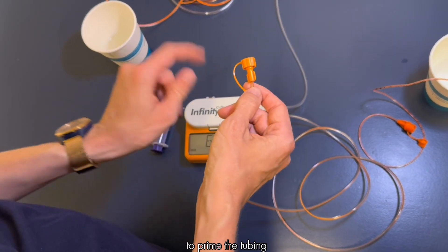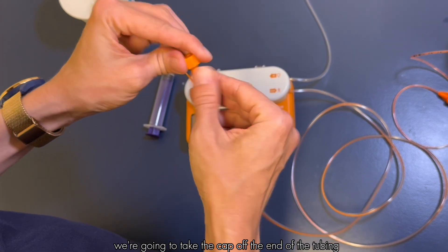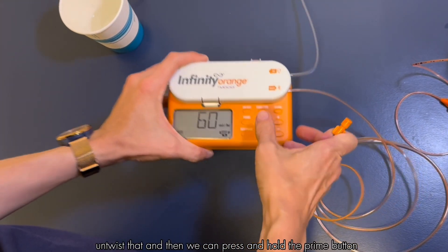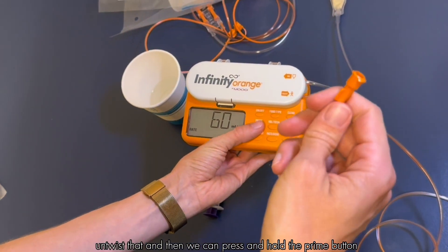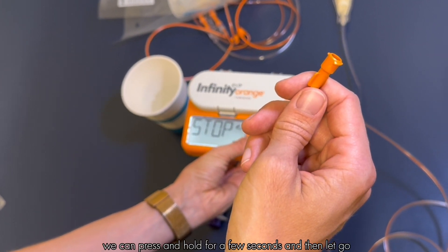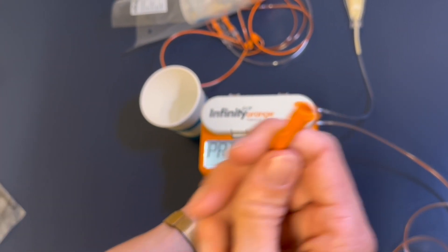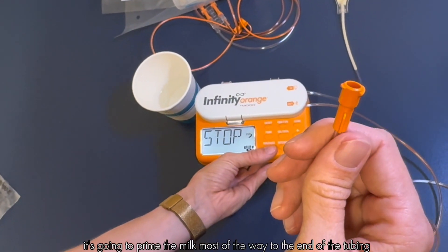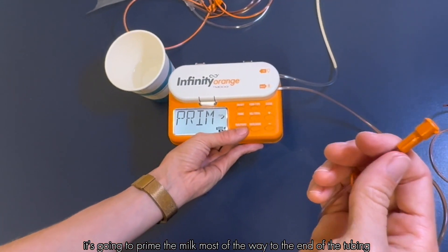To prime the tubing, we're going to take the cap off the end of the tubing, untwist that, and then we can press and hold the prime button. We can press and hold for a few seconds and then let go. This pump has auto prime enabled so it's going to prime the milk most of the way to the end of the tubing.